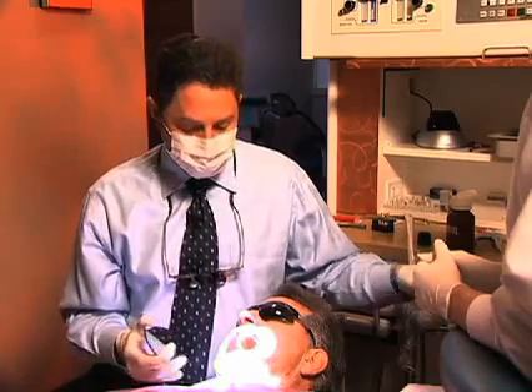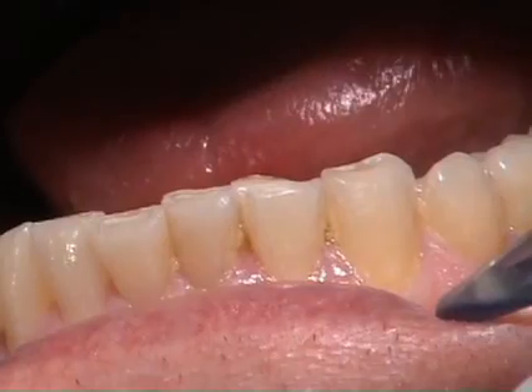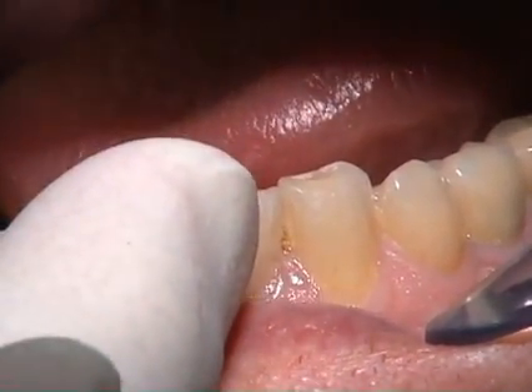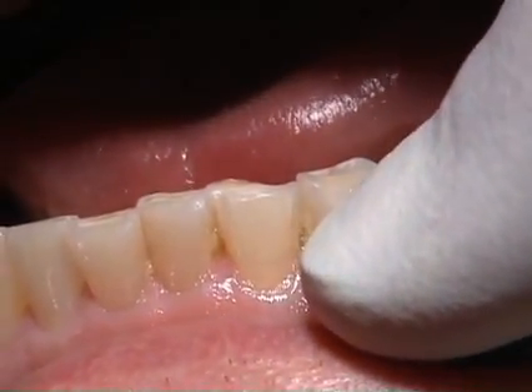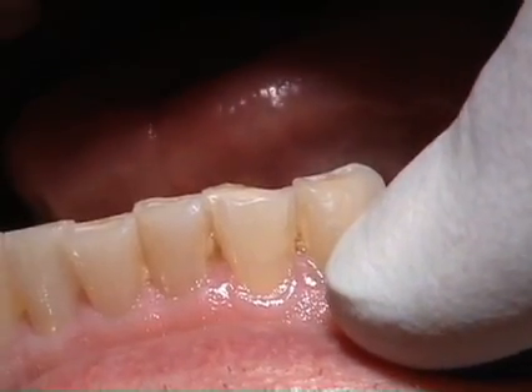Today we're going to be restoring two teeth on Jim here — tooth number 22 and number 23. As you can see, Jim has worn down the incisal edges of both teeth. He's fractured off the distal incisal edge of number 23, likely as a result of his lack of canine guidance with the wear and infraction on the incisal tip of number 22.